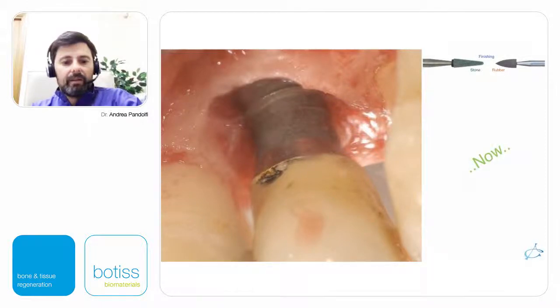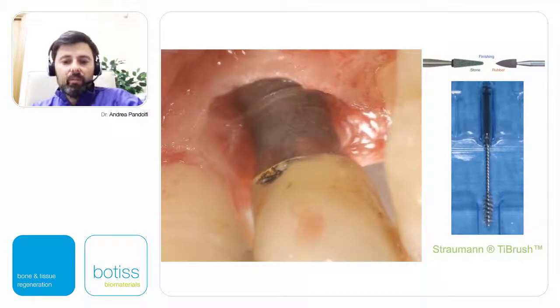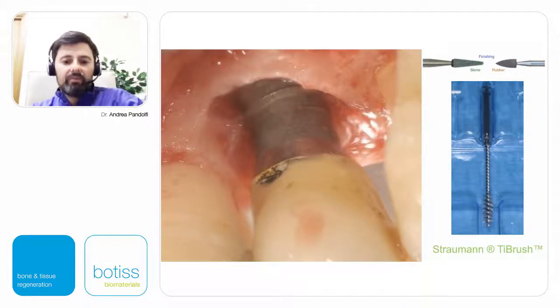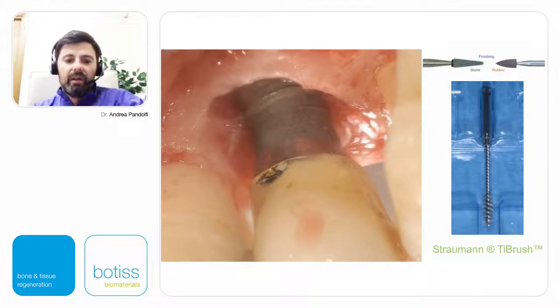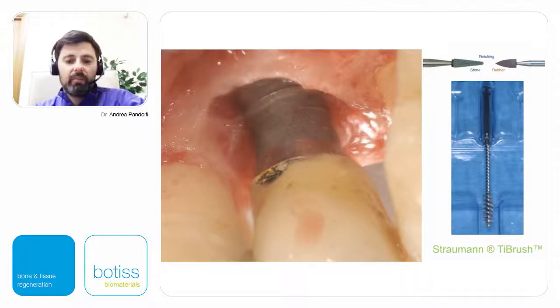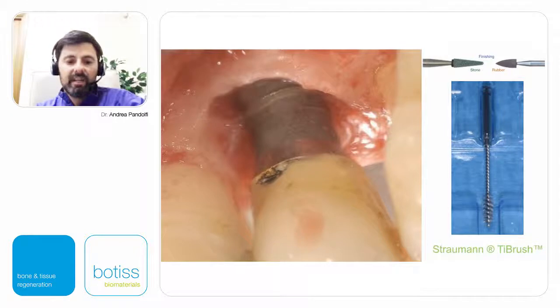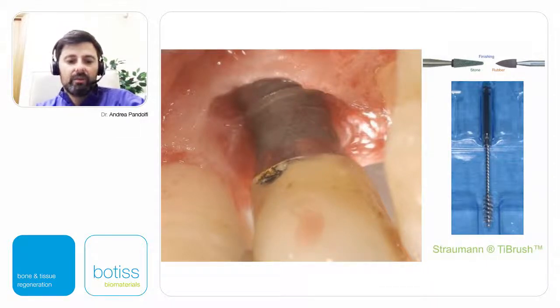After the cap-shape resorption was debrided, we used hydrogen peroxide 10 volume alternated with saline solution and chlorhexidine at 1% gel. This surgical procedure allows us to fully observe the bone defects around the implant and identify any prosthetic complications. In this case, apical chipping was corrected with a finishing stone and rubber. We now also have titanium brushes for implant surface cleaning. Glycine powder can be used to speed up the cleaning procedure, with the soft tissue protected to avoid tissue emphysema from air pressure.